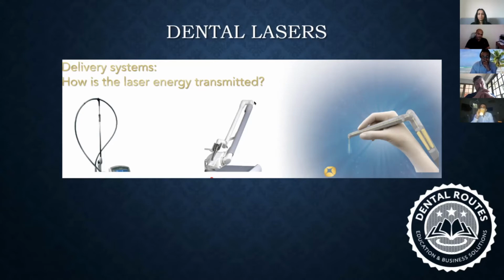But because it's a very long distance and it's made of multiple components, just a slight amount of movement anywhere will then change the way the mirrors are angled. Just a tiny bit of a difference in angulation, and the whole beam reflection pathway changes. And that is going to bring a lot of problems in the final delivery of that laser beam.